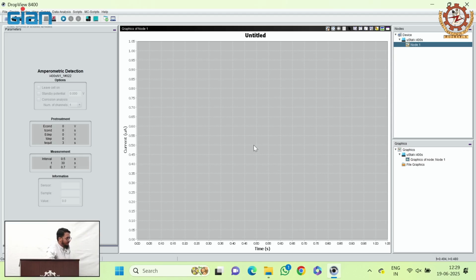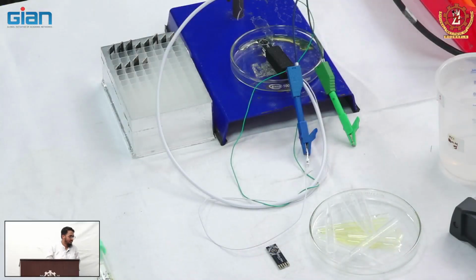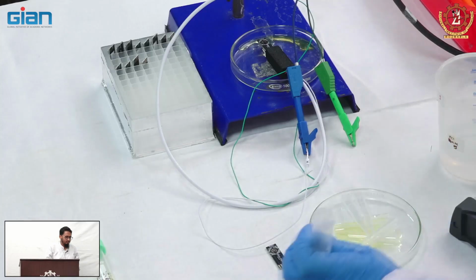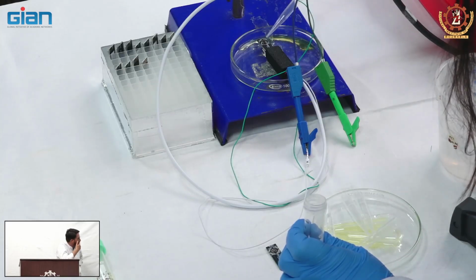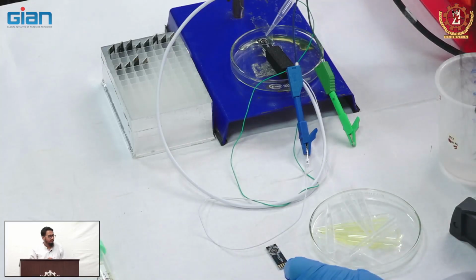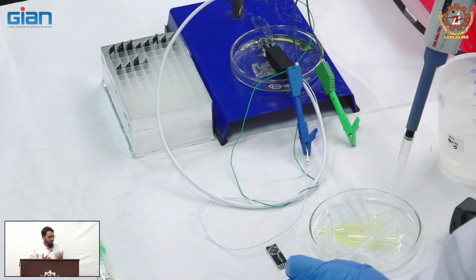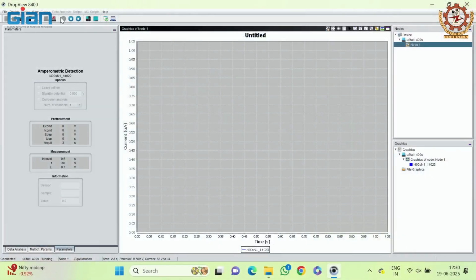We'll see what we are getting. Ideally, you would repeat this 3 times to get a nice calibration curve. Let's see what we are getting this time. It's always more fun to do hands-on. We see theory in practice. Yes, last one. Let's see. Then we'll plot the curves in Excel. Ready? Screen. Yeah. Started.